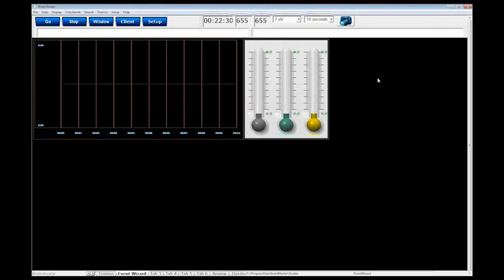Somebody mentioned before a second monitor. Yes. I just wanted to let people know, I come from the virtual reality end of this stuff. That's how I got into this. Sony has just come out with a remarkable headset that I've been using with my patients as a second monitor. It's a 3D effect, and the audio is excellent. It works very well with BrainMaster.